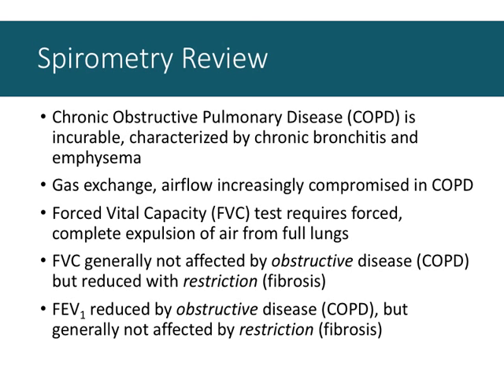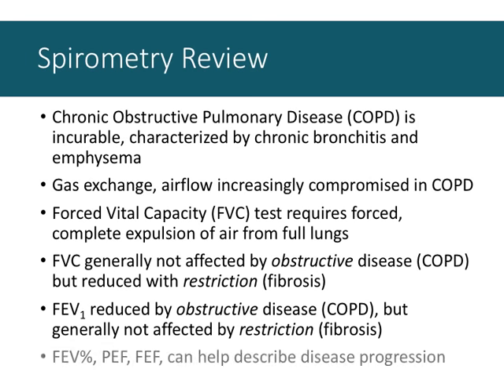Restrictive disease does not often affect FEV1 because the airways that are present are still intact. It's simply that the capacity is reduced. And then we talked about some other factors that help to describe the progression, the advancement, or perhaps where the obstruction might take place. The shape of the graph can tell us a bit about these things as well.